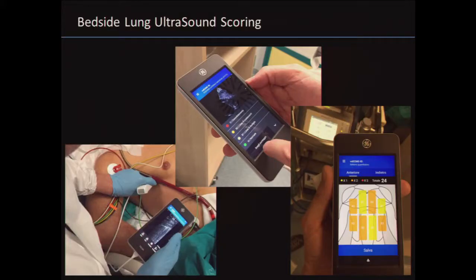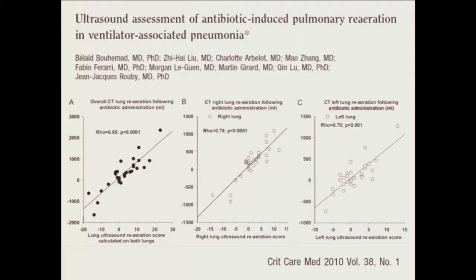And now these pocket-size ultrasound systems are available, so you can obtain a picture on your patients and review and score and save your score bedside.